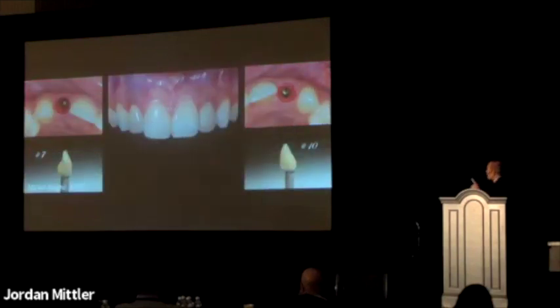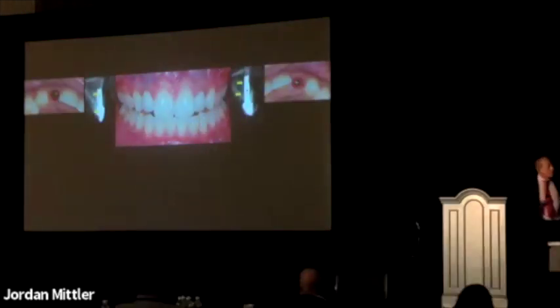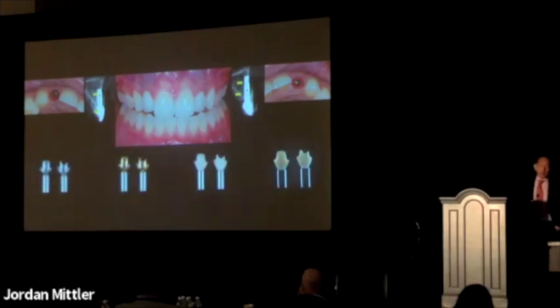You can see that the tissue on the left was much thicker. The keratinized tissue is robust, thick, and full, whereas the one on the right is thin. All because I was 0.5 millimeter off. In small spaces, it can have a profound effect on your tissue thickness. And this is how you follow the patient. You can see now the one on the right is going to need a soft tissue graft, whereas the left doesn't need one. The tissue thickness is dependent entirely on implant position.